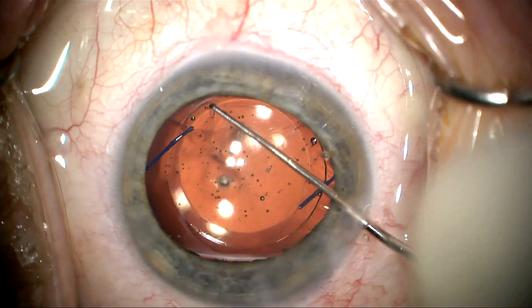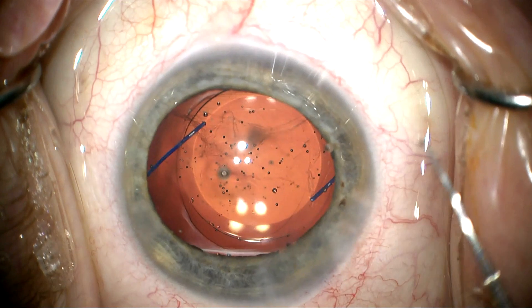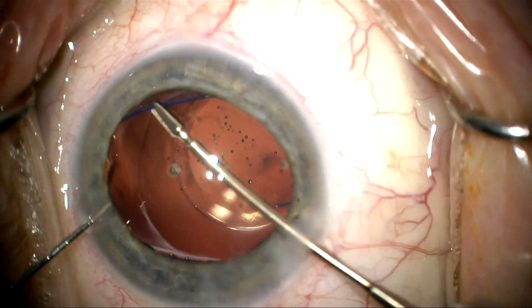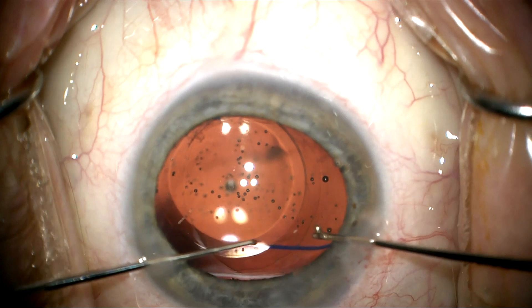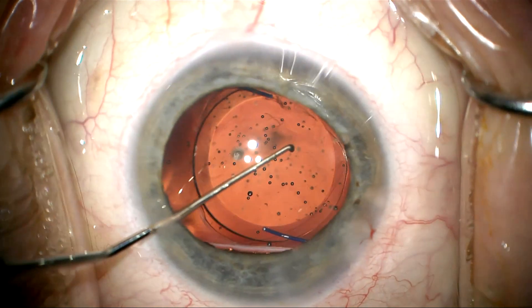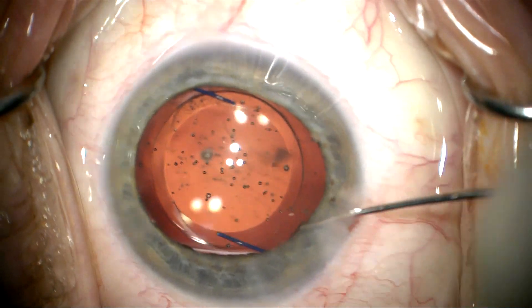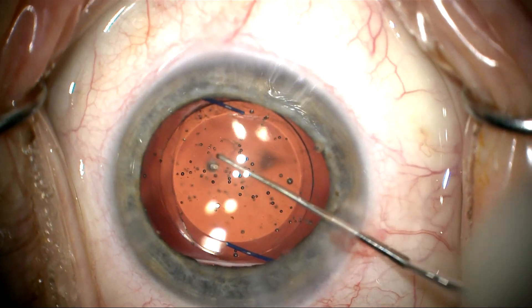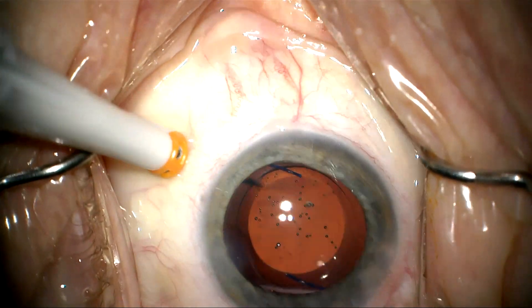I'm going to push that redundant posterior capsule back. I feel like the capsule is intact, but it's just very loose. So I'm going to make a decision to take this lens up out of the capsular bag and put it in the sulcus and optic capture it, where I think it'll be more stable. I notice there are vitreous floaters floating around behind the posterior capsule, and I feel this patient would benefit from a vitrectomy and a capsulectomy. She did have a posterior vitrectomy in the other eye but not in this one, so I'm going to optic capture this lens and then do a three-port pars plana vitrectomy to clean up the posterior capsule and the vitreous floaters.